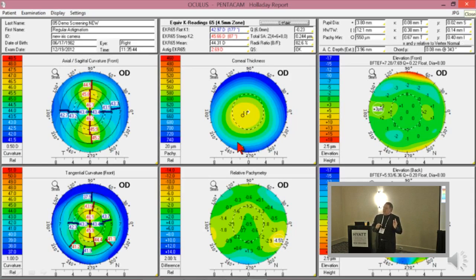Well, if you take that 44, that 1 diopter less, and plug it into one of the lens formulas, it doesn't know that you've made that conversion already. So the result is it reduces it down to 43, and all of a sudden you put in a K reading that's 1 diopter flatter than you meant to, okay?